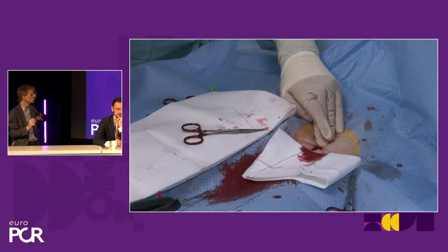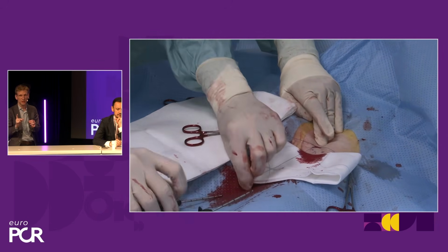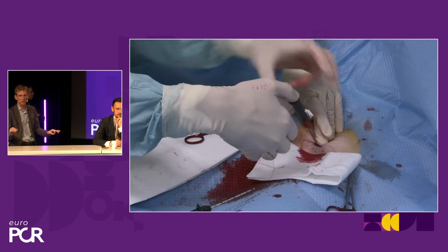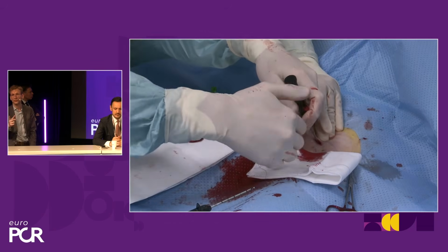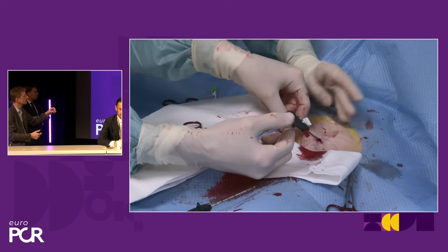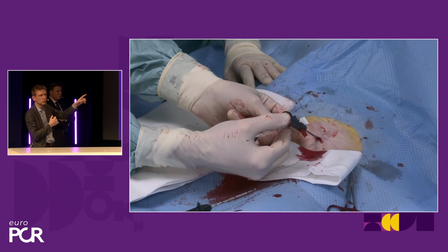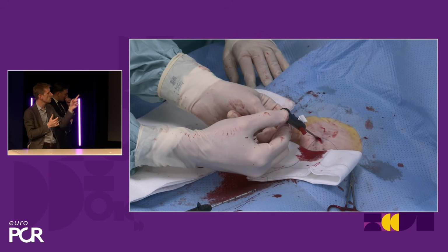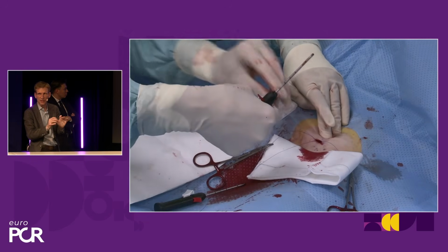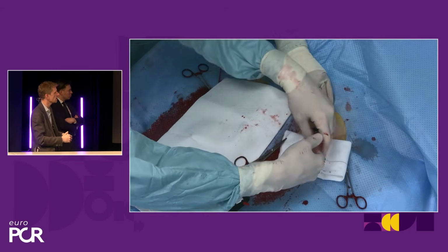What I don't do is pull on the short end of the suture, because you have to know that as soon as you pull on the short part, you lock the knot, so you cannot push down further. That's only at the end when the wire is fully out. So now you see I'm pulling on the short end of the suture where my forceps is. Now I fully lock the knot, and it will not go further down or up. I completely sealed it.